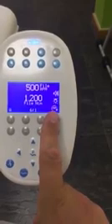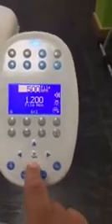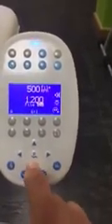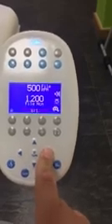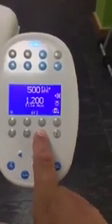The next thing I'm going to talk about is auto forward, auto reverse, which is in the bottom right hand corner here. So again, press a plus or minus, which will get me back into this menu. Use the chair position keys to move me down and then across to this section here. And I've got three options here. I've got normal, auto reverse and auto forward.